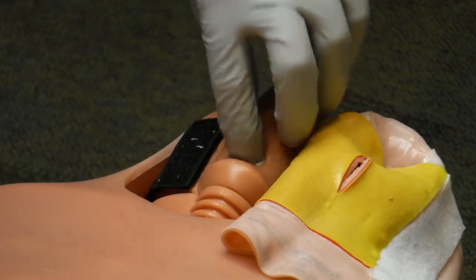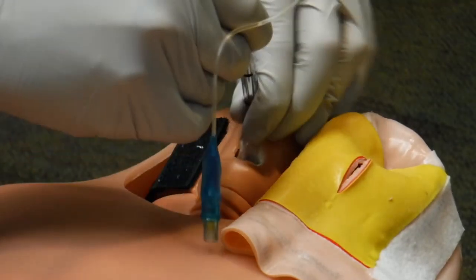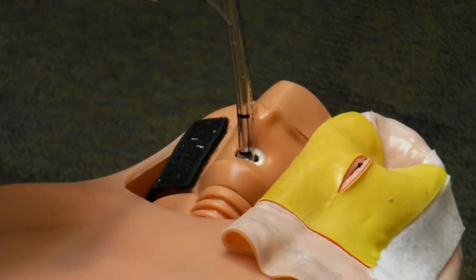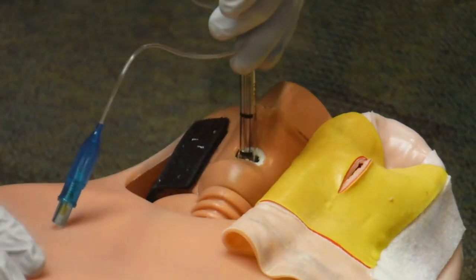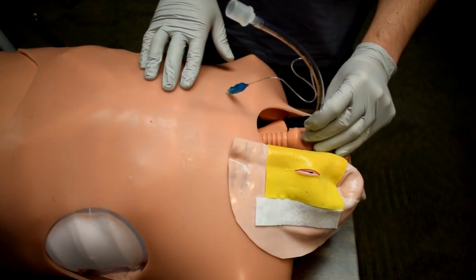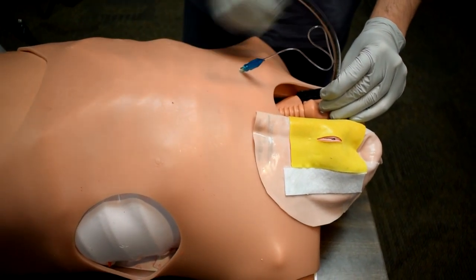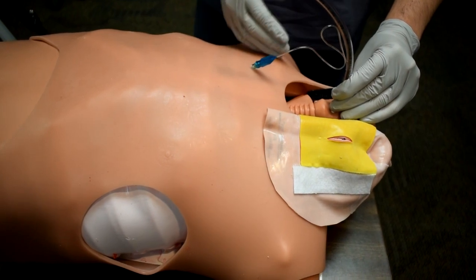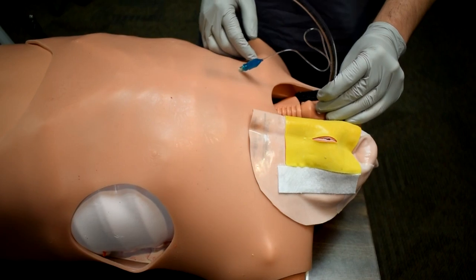Once I've dilated and verified my anatomy, the ET tube goes into the opening, and once the cuff is just inside, we inflate the cuff, and we attach our ET tube to a BVM or to a ventilator. And at this point, we've secured our airway. We hold the airway in place. We secure it with different techniques, but once again, recommending always to hold it with your hand. And then we move on to the next steps, which is going to be getting a more definitive airway, which could possibly include doing a formal tracheostomy in the operating room.